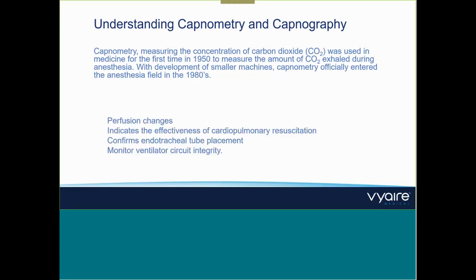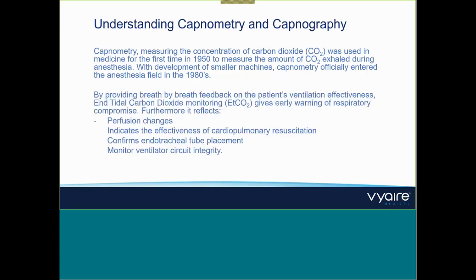You can really monitor lots of processes when using capnometry, for example, perfusion changes. Also, you see a lot about the effectiveness of what you're doing, especially when you resuscitate a patient. Of course, that's the reason why it's widely used in anesthesia and also in emergency, that you can confirm a correct placement of the tube, because when there is no CO2 coming back, something must be wrong.